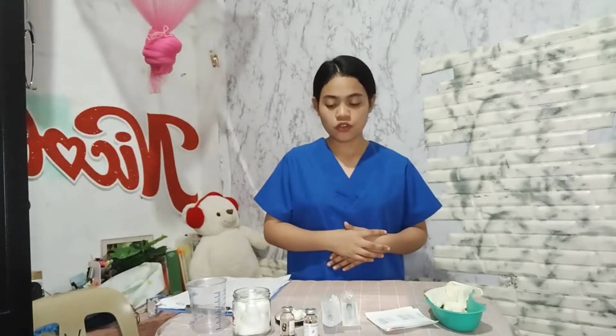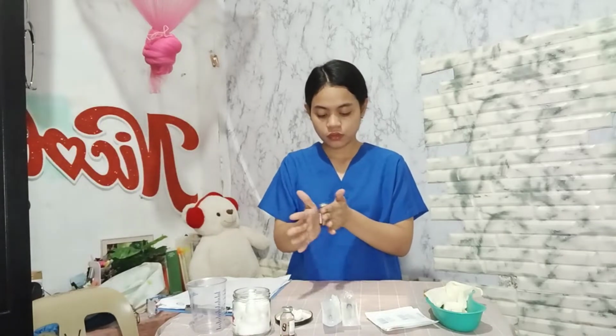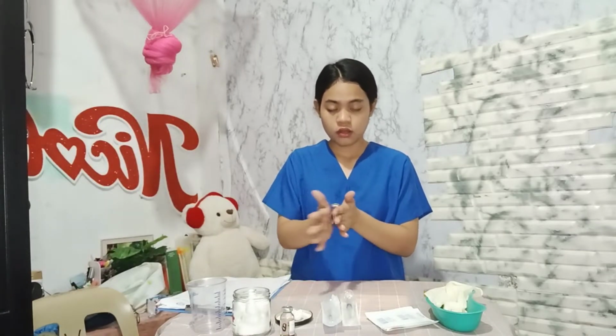Then next, prepare the medication vial for drug withdrawal. Mix the solution if necessary by rubbing the vial between the palms of the hand, not by shaking. So simply rubbing the solution. Then we can now put on the gloves.